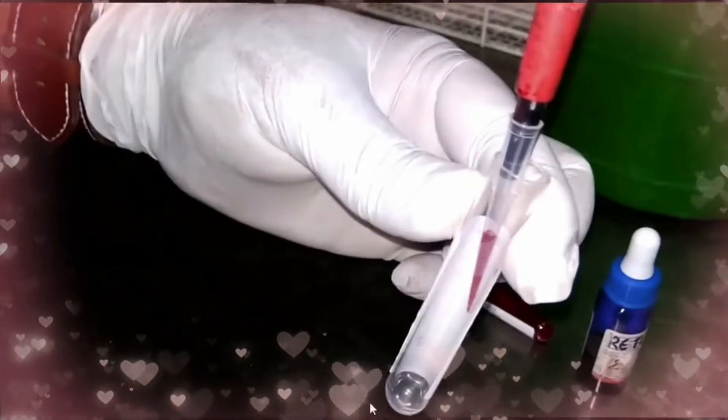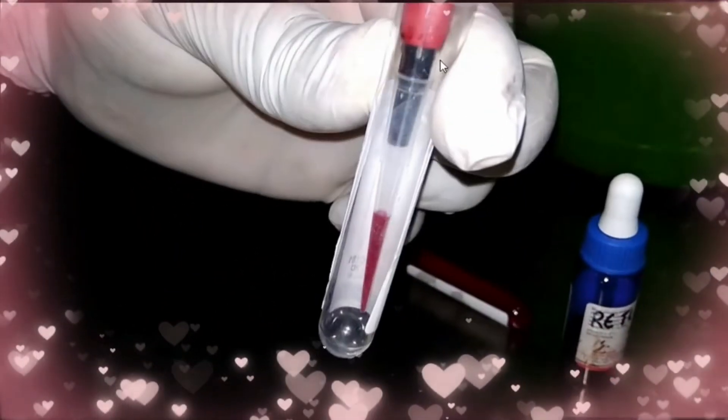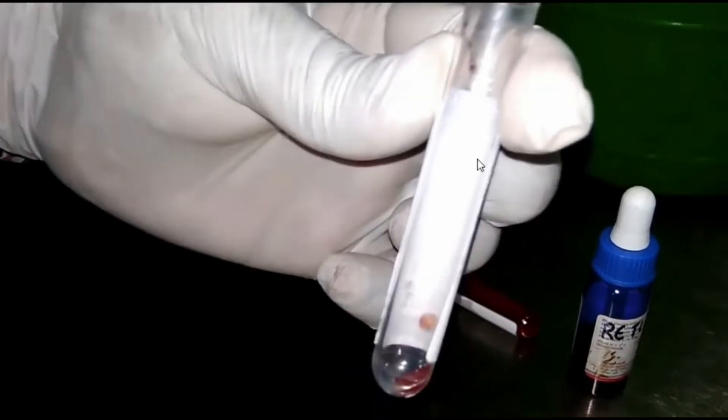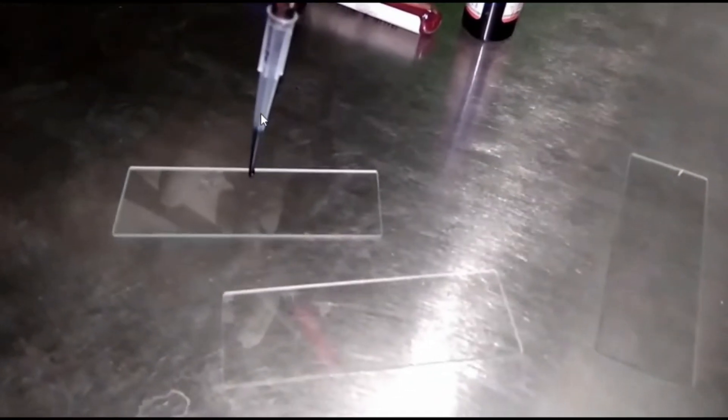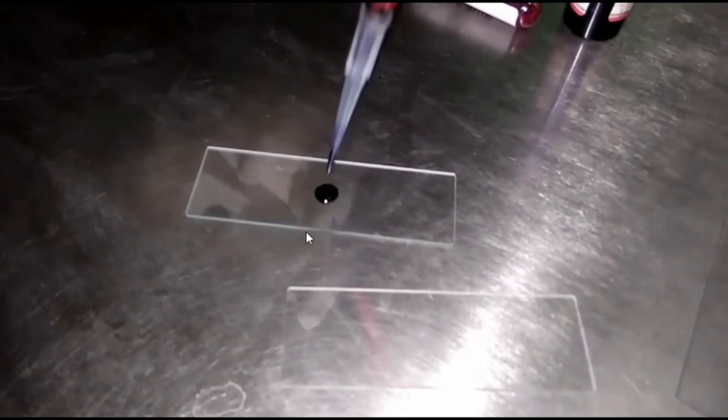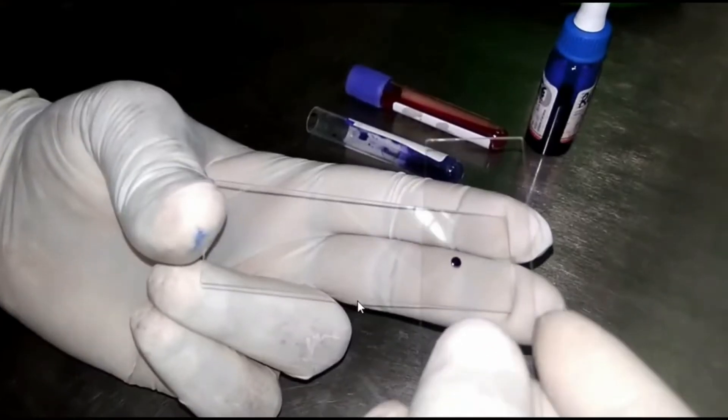Take equal amount of blood and vital stain. So here we have taken 100 microliters blood and 100 microliters methylene blue. Mix properly. Now put a drop on this slide and a small drop on this slide. Make a smear in this way.